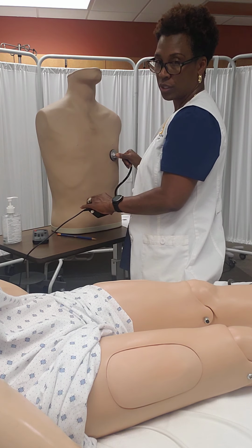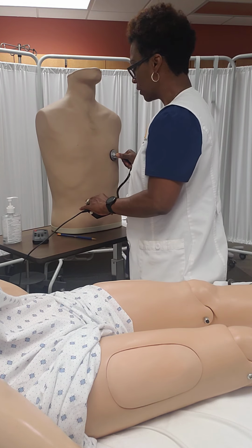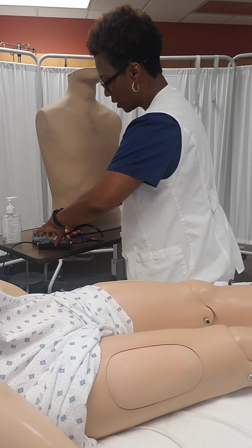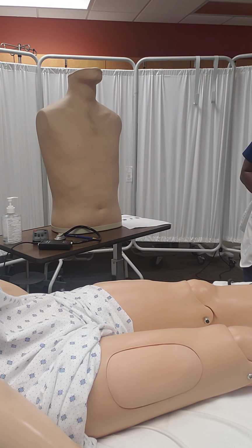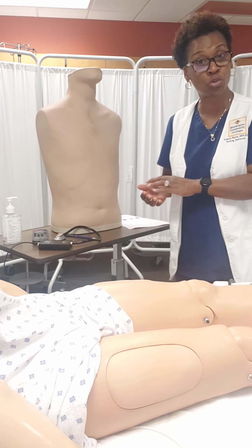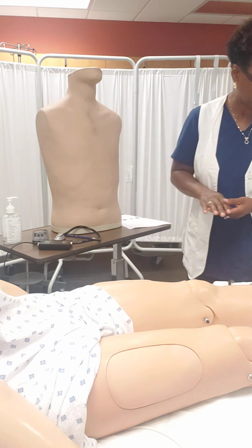Okay, so you'll get an opportunity to come in here and listen to these sounds. I can switch them up to make them sound very different, and you'll be able to too, but I want you to get to know what normal sounds like, okay? So that's what you're going to do. You're going to listen to the listening points. You're going to listen to all the different heart sounds, and be able to identify S1 and S2 with your stethoscope. Where would you hear the loudest sound, either S1 or S2? Those are things that I want you to go and read and make sure that you understand prior to coming in for your test out.